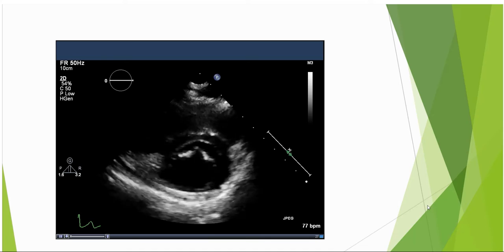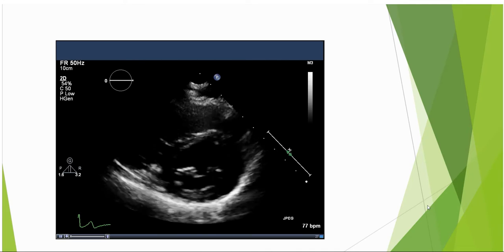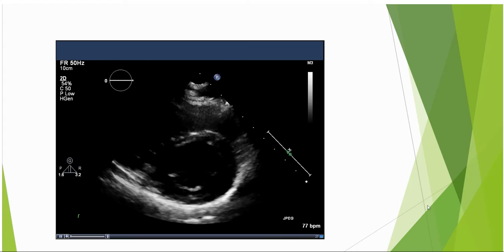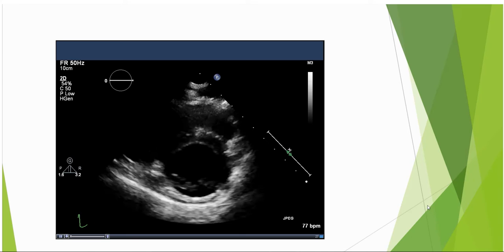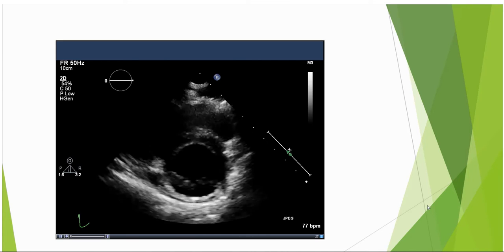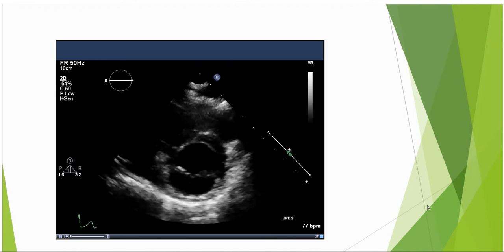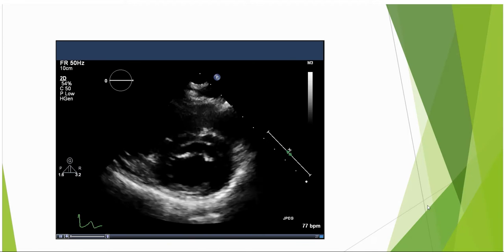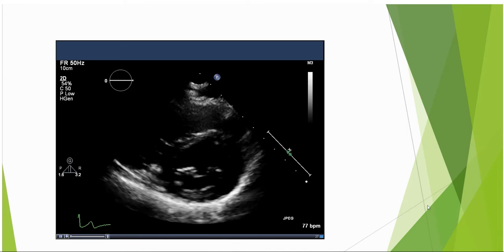Here is an example when an automated gain setting has been used. Overall, the image quality is fine, but detail to the left of the image is lost. This is the area of the right ventricle in short axis, and it is desirable to obtain this detail in a routine exam. Had the sonographer bumped up the sliders of LGC that affected the left of the image, we may have been able to see the detail of the heart wall. TGCs could have been applied for these depths, but that would over-enhance the other structures which have good gain settings. Turning up the overall gain would similarly have undesired effects for the rest of the image.